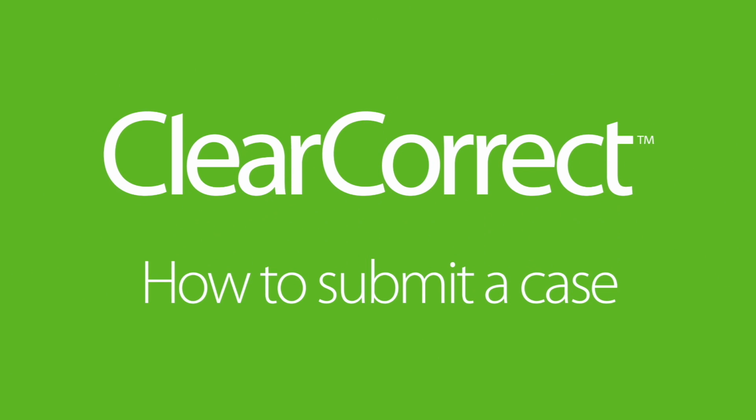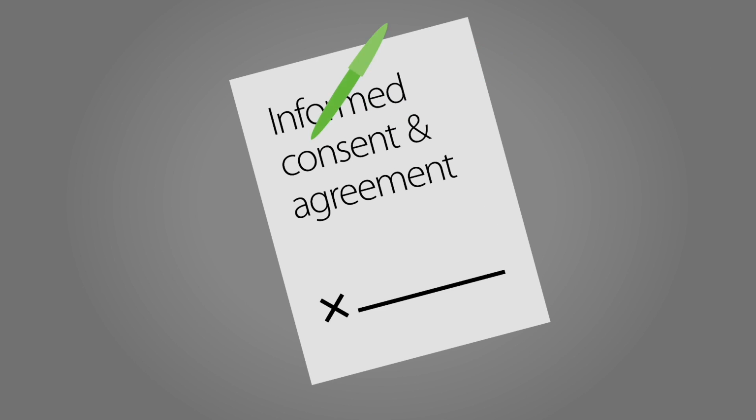Here's how to submit a case to ClearCorrect. Before you begin, have your patient read and sign an informed consent and agreement. It's important for your patients to understand the risks and benefits of clear aligner therapy. Keep this for your records.